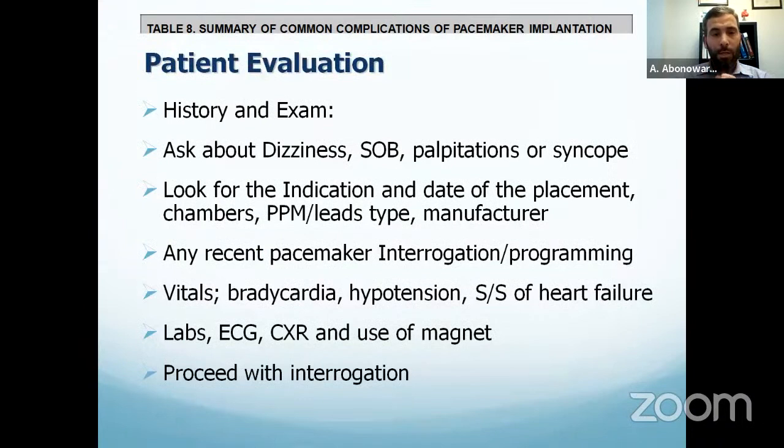So for anyone who sees patients in the emergency department after pacemaker implantation, we go to the basics by taking a quick history and physical exam. Make sure you look at the site of the pacemaker, listen to the chest of the patient and the heart. And also symptoms: is it dizziness, syncope, shortness of breath, palpitations. Again, look at the pacemaker.